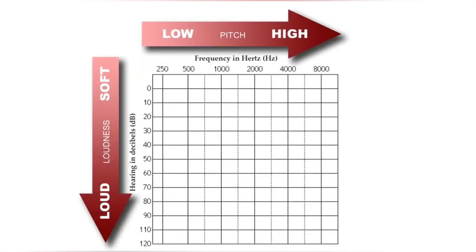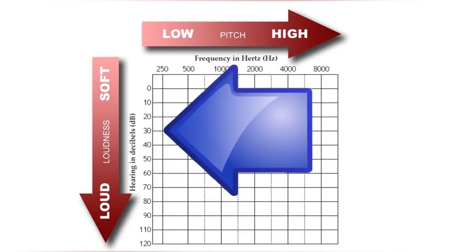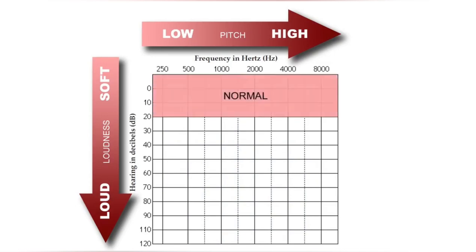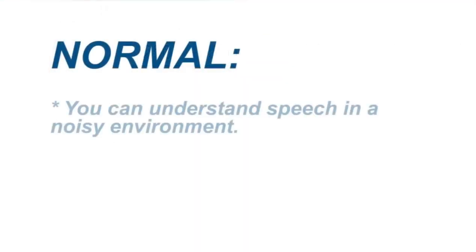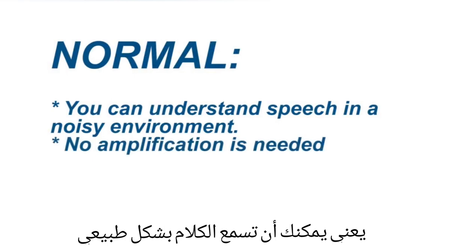Let's take a moment to focus on the sound loudness, which runs from top to bottom and is measured in decibels. If your hearing is normal, you should see an X or a circle that falls into the 0 to 20 decibel range for each frequency. That means you can understand speech in a noisy environment and no amplification is needed.